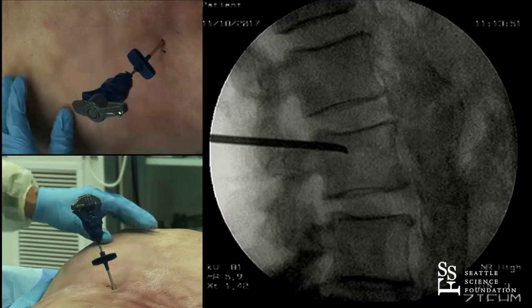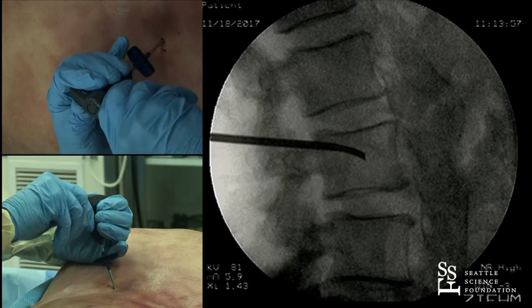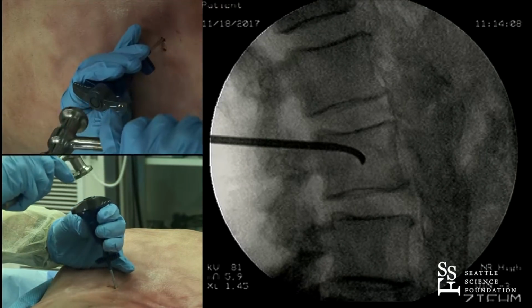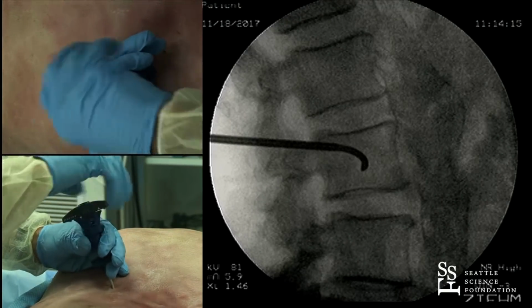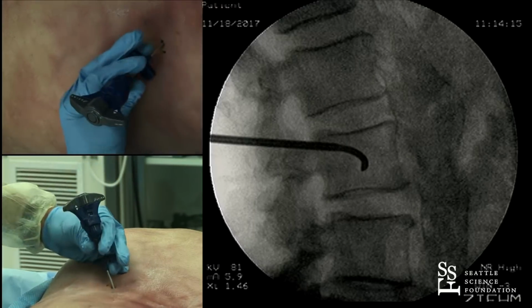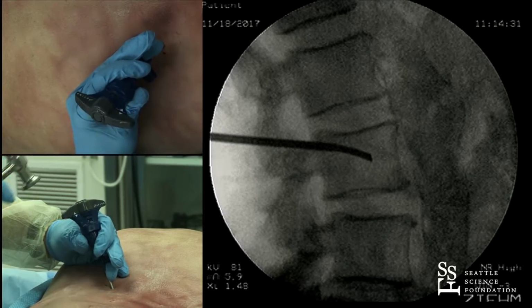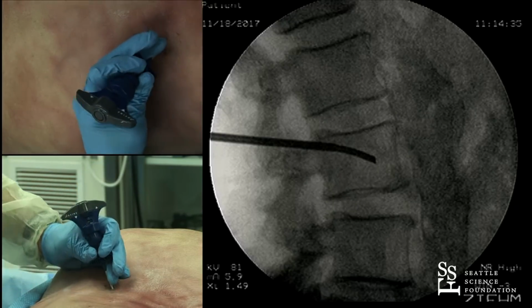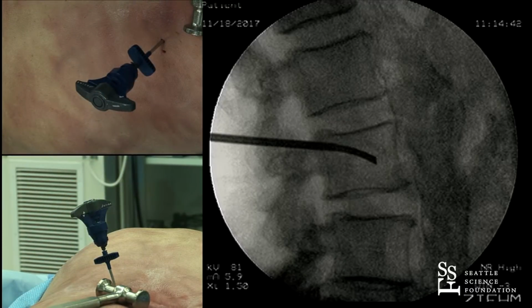And we'll take it and advance it. And I will put some more torque on it to get the curve to actuate more. And that's right in the center of the vertebral body. This is really pretty powerful. Almost a complete curve. And so for this, I'm going to pull it back a little bit, and we will put it out slightly straighter. Nothing wrong with having it right in the center of the vertebral body, but I want to demonstrate this and have the curve actuate a little bit more toward the anterior portion of the vertebral body, because I'd like to get toward the contralateral side and see how we do there.